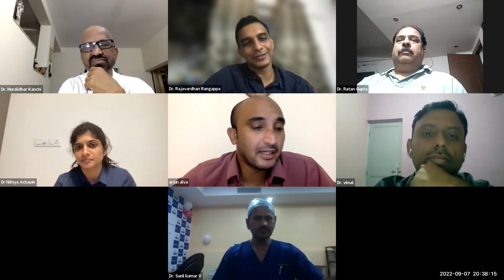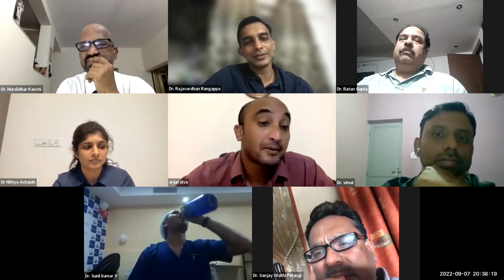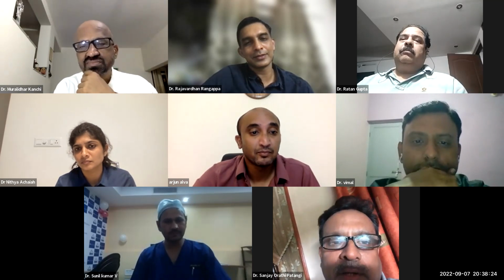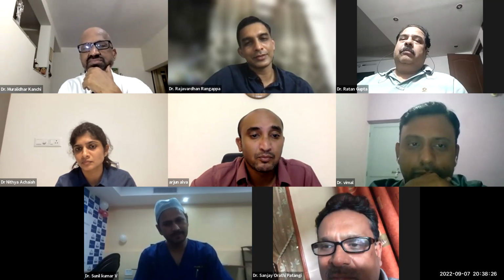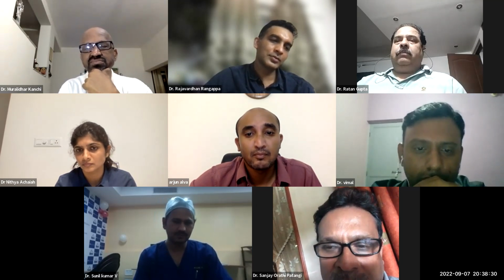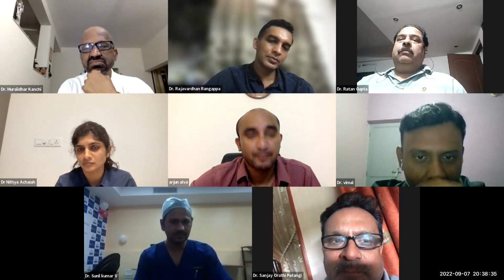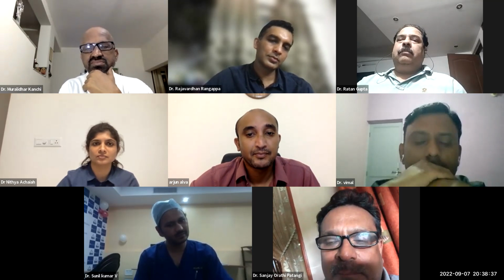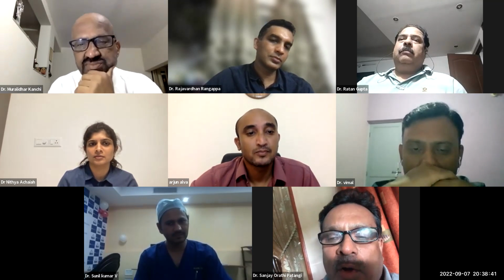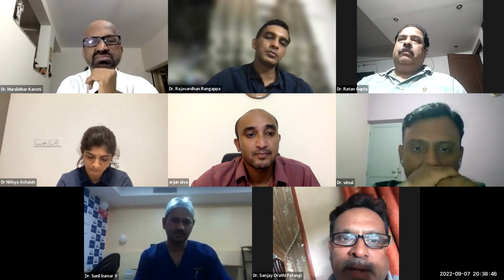Okay. Is it available in India, Sanjay? Yeah, there are two. The Avalon is the conventional double lumen cannula which is used in the West. It's incredibly expensive, so it has not yet made inroads into India. But there is an Origin cannula which is produced locally in India. However, there is a very big shortcoming in its profile. The Origin unfortunately doesn't come with a dilator set, which the Avalon comes with.